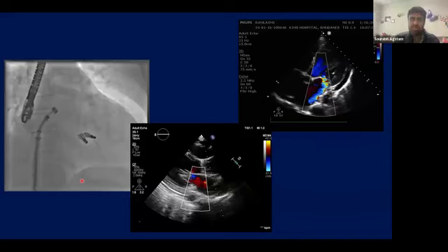So, sir, what is the main difference between NTR and XTR, apart from size? Will we need fewer clips if we use XTR over the NTR, or is it the same? No. It is basically depending on the length of the AML and PML leaflets. How much length do you consider optimal for the clip, sir? More than 10. Sometimes the PML is shorter. If the PML is less than 10, then we should not go ahead with it because it becomes a very complicated scenario then. Okay, sir. Thank you, sir.